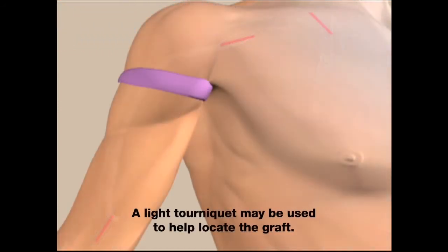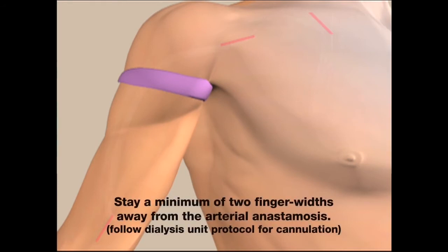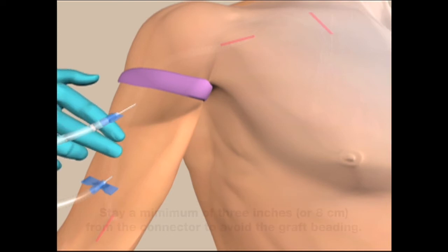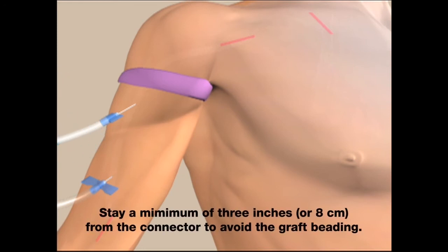A light tourniquet may be used to help locate the graft. Stay a minimum of two finger widths away from the arterial anastomosis and follow dialysis unit protocol for cannulation. Stay a minimum of three inches or eight centimeters from the connector to avoid the graft beading.